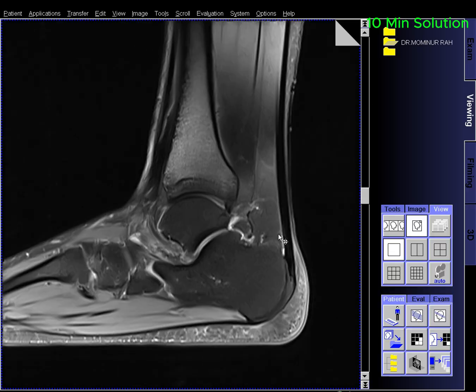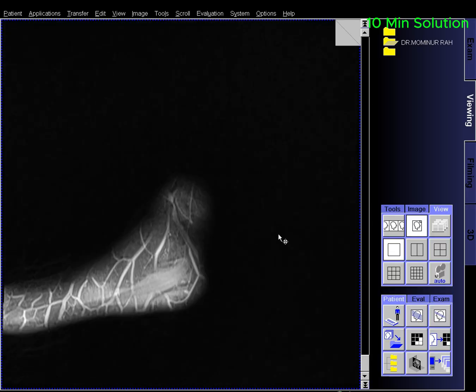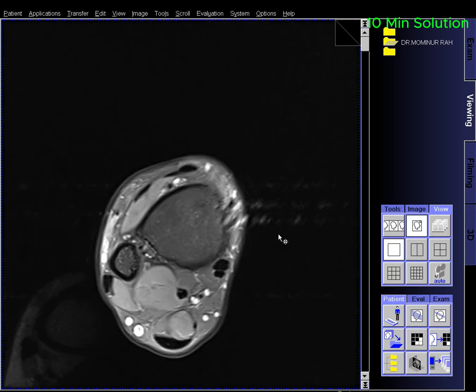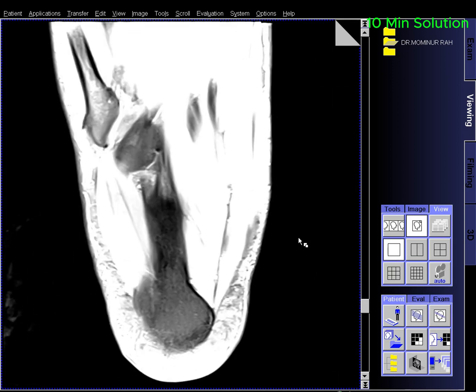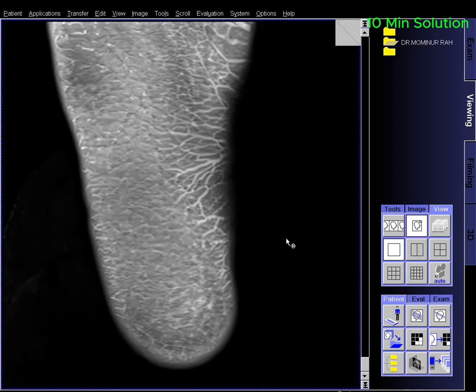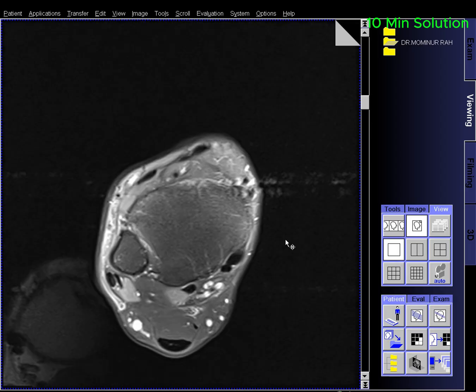Contraindications. Any electrically, magnetically, or mechanically activated implant, for example, cardiac pacemaker, insulin pump, biostimulator, neurostimulator, cochlear implant, and hearing aids.